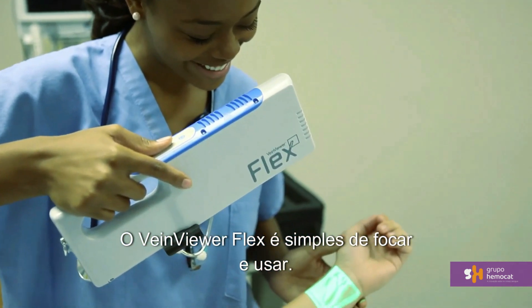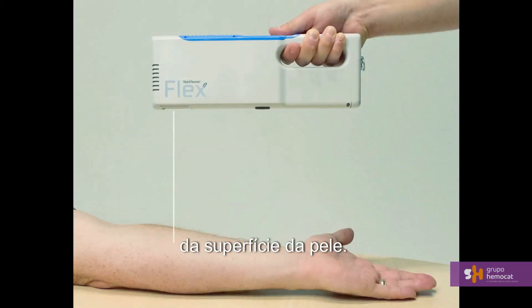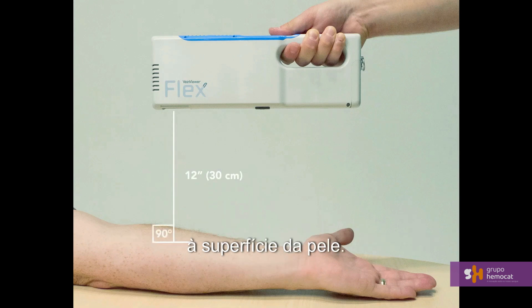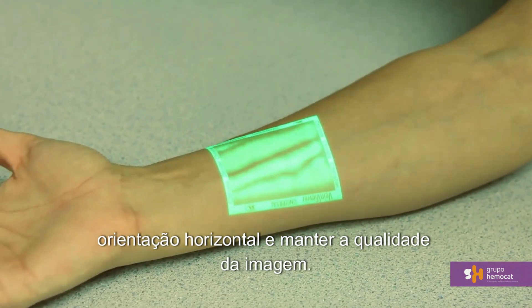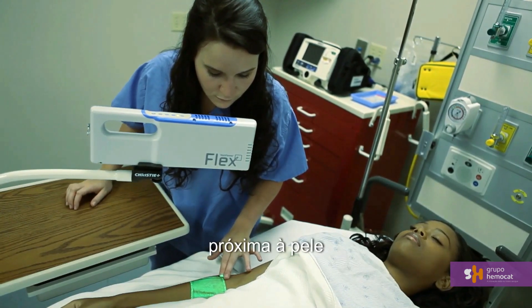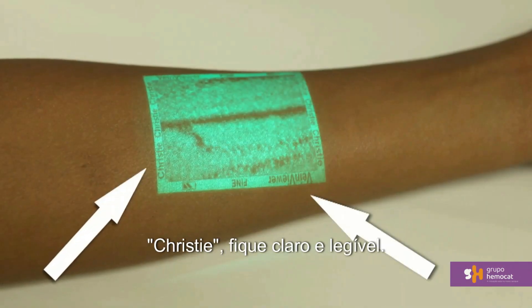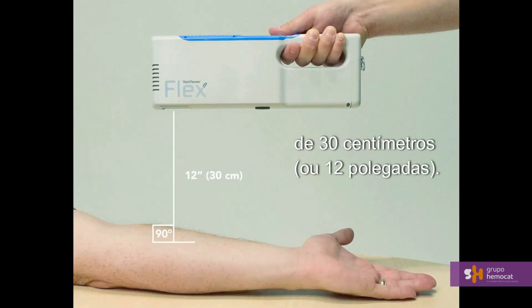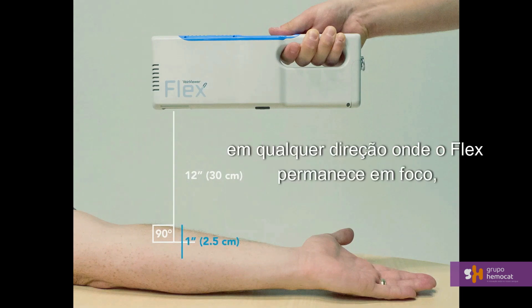VeinViewer Flex is simple to focus and use. The proper focal distance is 12 inches, or 30 centimeters, from the surface of the skin. Flex should also be held as close to perpendicular, or 90 degrees, to the surface of the skin as possible. Once perpendicular, rotate the device in any horizontal orientation and maintain image quality. To achieve proper focal distance, hold the unit close to the surface of the skin and move the unit away until the border text — reading VeinViewer and Christie — becomes clear and legible. You should be at the proper focal distance of 12 inches, or 30 centimeters. There is a one-inch window, or approximately two and a half centimeters, in either direction where Flex remains in focus, helping to account for patient movement.